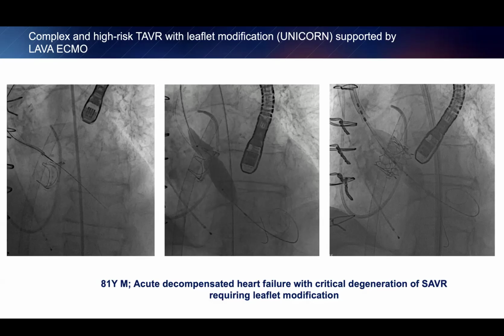We talked about it in our faculty meeting, and I think for that particular case, we should get the surgeons to implant a Protek Duo, which is a 31 or 32 French dual lumen cannula that goes through the IJ, and it will provide enough support to do that.